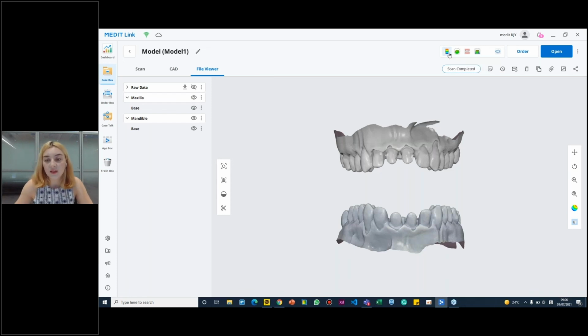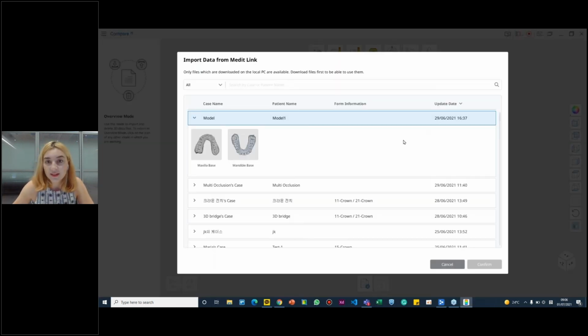So you will see, Maria, as usual, I interrupt a lot, and you know that. I'm sorry. So you have the original scan data for this file, and that file goes to either 3D printing company, so you can actually test the accuracy of those printed models, and then you can make your decision from there. Okay. Yeah. Okay. Just to clarify. Thanks. Yeah.